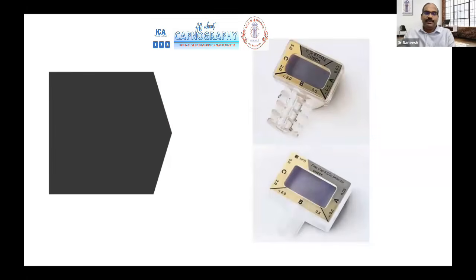Okay, who is going to attempt this? What is the significance? Anybody, you can volunteer. Yeah, Dr. Manas. It's a colorimeter. Okay, sir, how does it work? It senses the carbonic acid released from the body, like the CO2, and it changes the color, purple and other colors.